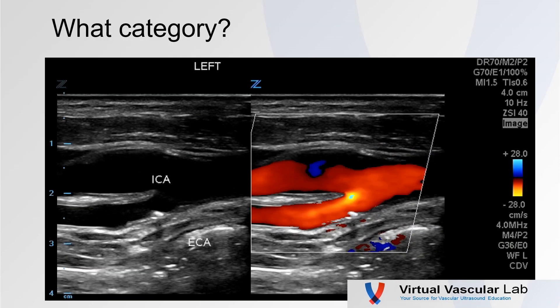How about one more video clip? This is just off the grayscale and color Doppler imaging. We can see some plaque along the external — it doesn't really look like there's any flow disturbance. Note that internal: not only do we not see any plaque within the image, but note that helical flow, that flow separation in the bulbous area in the proximal ICA. That helical flow and flow separation is the hallmark of a hemodynamically normal internal carotid artery. When we start getting disease there, we'll lose that flow separation — just a little hint.